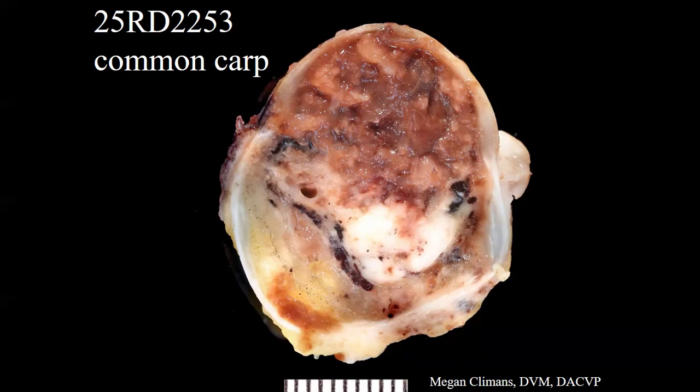or white blood cells. The appearance in the anterior chamber is heterogeneous. Structures such as the lens cannot be easily identified. Suspect chronic inflammation, eye is not visual, and they took it out. The right eye also had a bit of a mild corneal abrasion, but was not the eye of maximal interest here. So their assessment by ultrasound is pretty much our assessment by gross view.